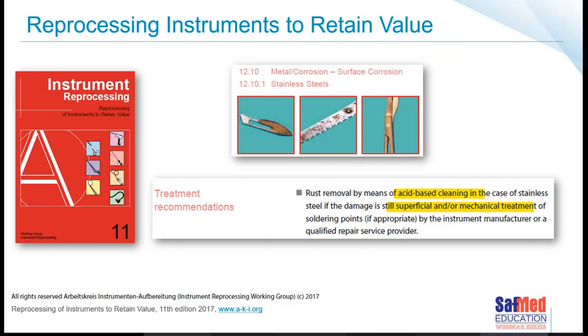I really am not fond of bowls of water. The slushing around of the bowl of water when you transport it from the operating room to the dirty side of the CSSD is in itself an issue, and leaving the instruments to lie like that in water is not the best idea. It really isn't. So that's why I tend to be in favor of the products that contain the corrosion inhibitors. They're going to help try keep and maintain our instruments for as long as possible.